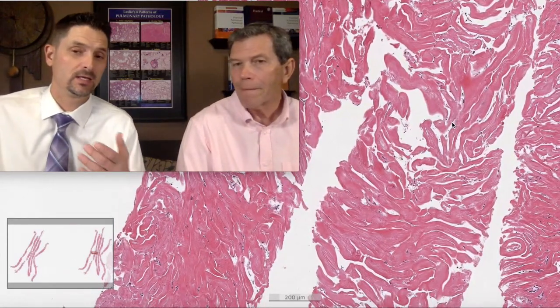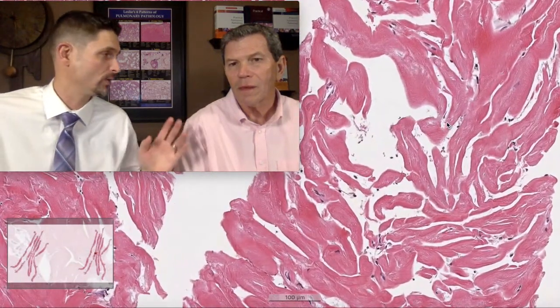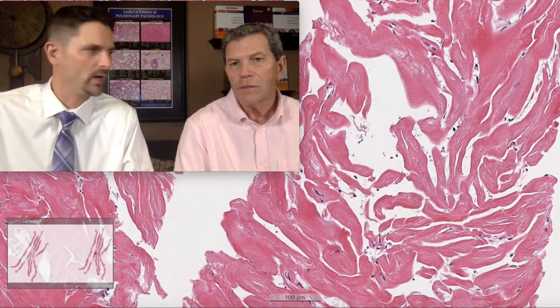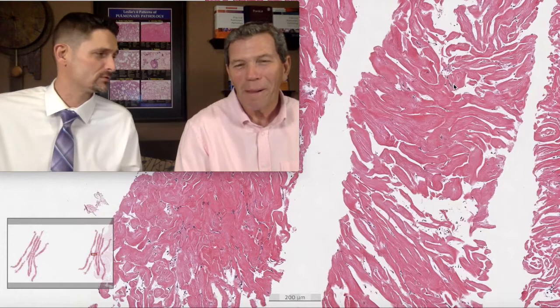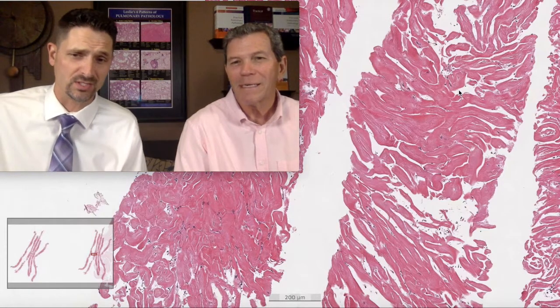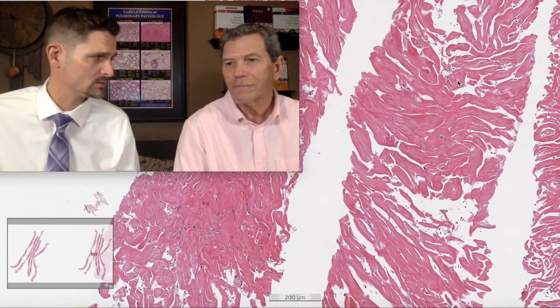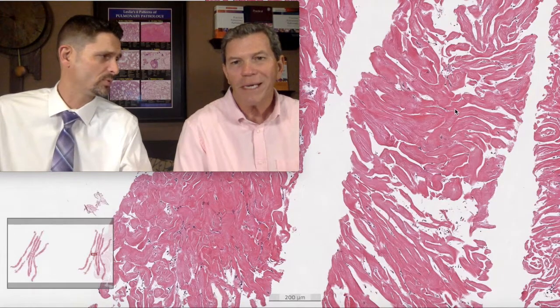And if I tried to sell you that this was a pulmonary hyalinizing granuloma, not knowing any of the history, you'd say, sure, why not? I'd say, sure, how big is it? It looks classic for pulmonary hyalinizing granuloma. In fact, I showed this to the visitors. I said, the morphology here, this keloid-type scarring, is classic for pulmonary hyalinizing granuloma. And then we talked about what an IPR was, instant pattern recognition. You see this in the lung, you say, okay, next case, the old pathologist, next case.